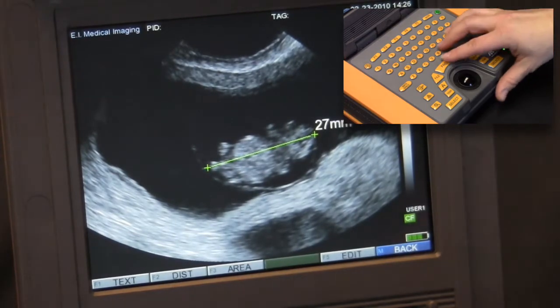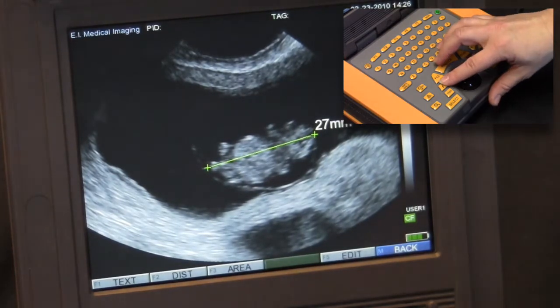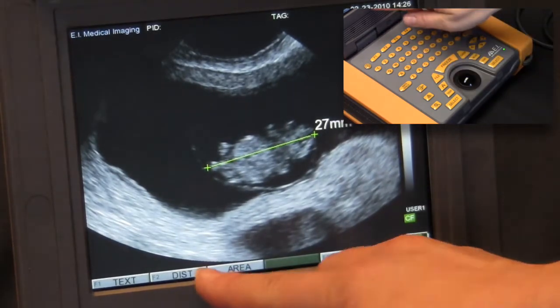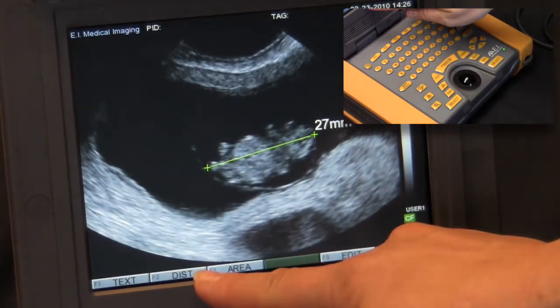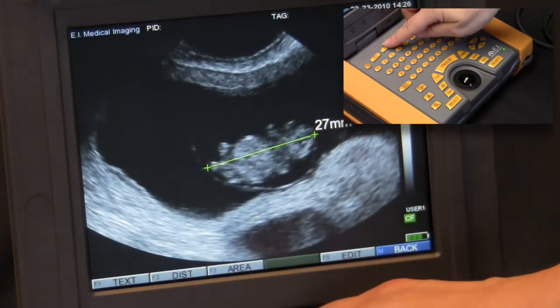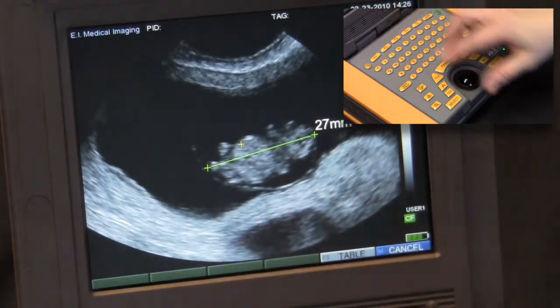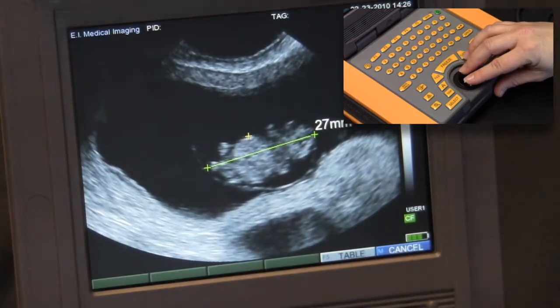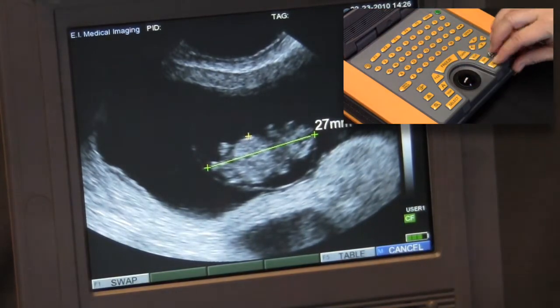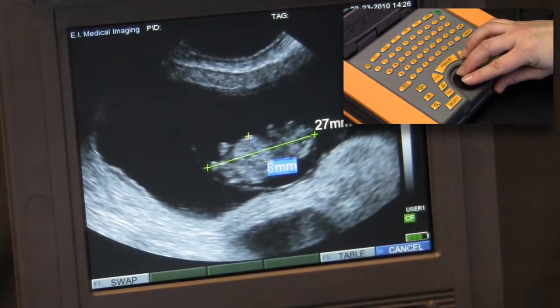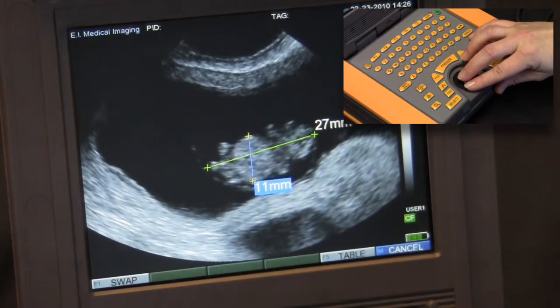Multiple measurements can be made on each screen. To start a second, simply press F2 again to begin another distance calculation. Again, pressing the select key commits the measurement.